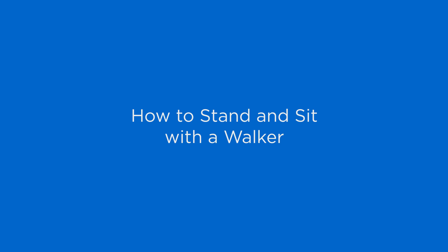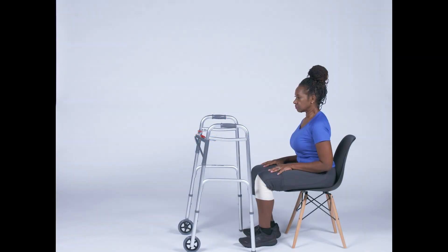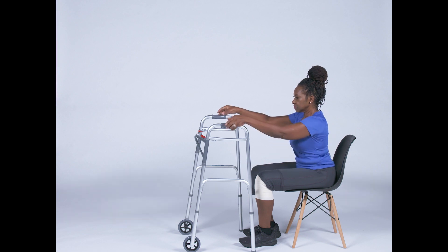Today we're going to teach you how to stand and sit with a walker. Start by clearing the area around you of any potential tripping hazards, such as a pet or a bag. It is important to have a safe environment when standing or sitting.